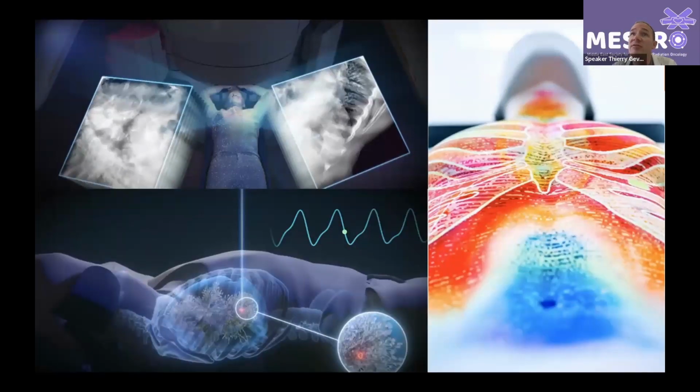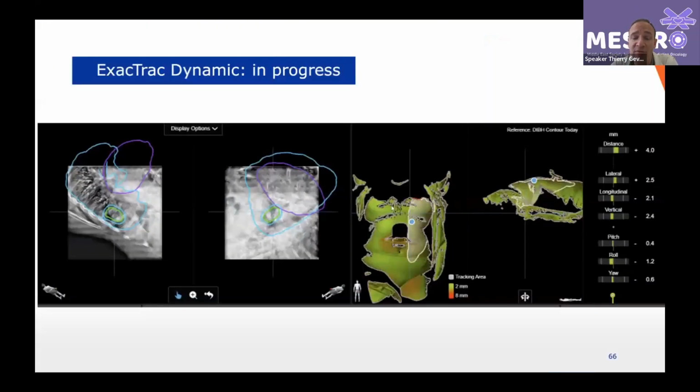What we are doing as research, I just wanted to show a little bit, as we are a university hospital, we also do some research. So what about lungs? We have some trouble when the lesion is moving more than 15 millimeters, what to do with it. We have some ideas: gating, breath-hold, and so on. We like to have those kinds of ideas. Our only problem is that the patient can drift.